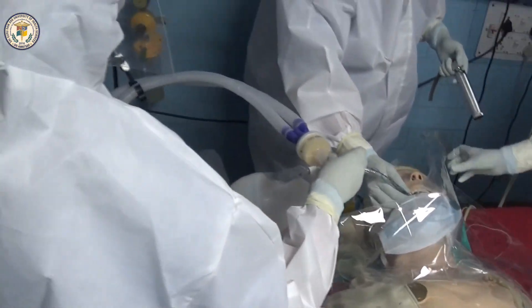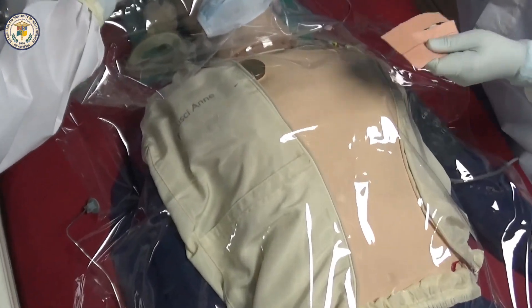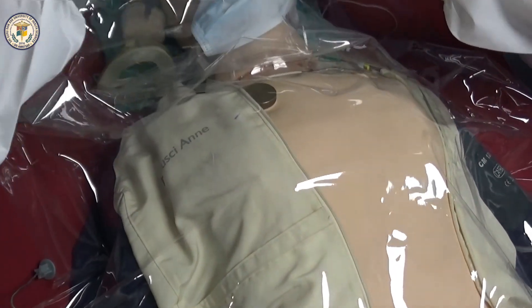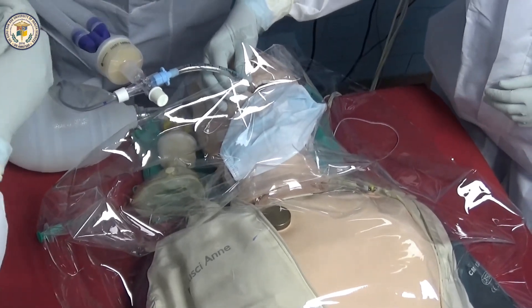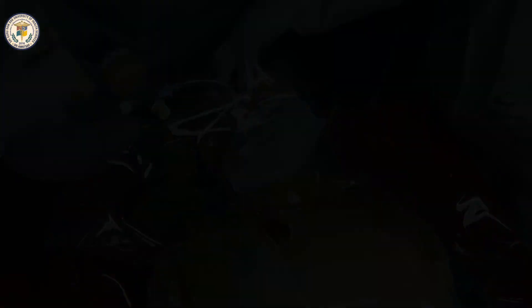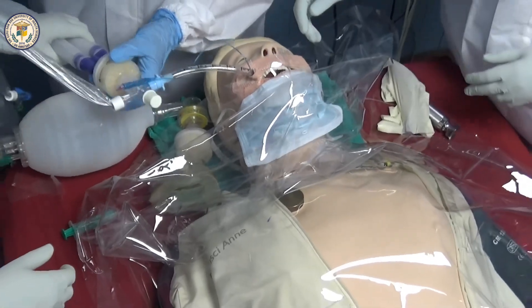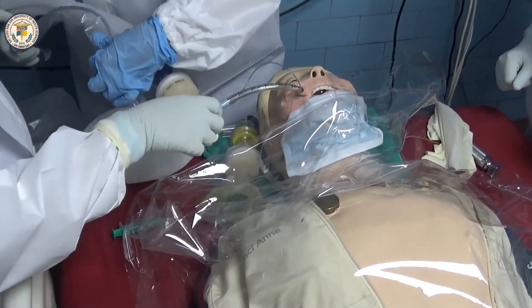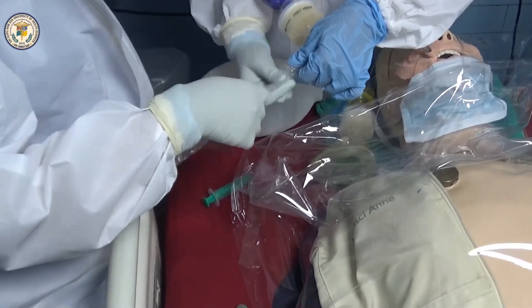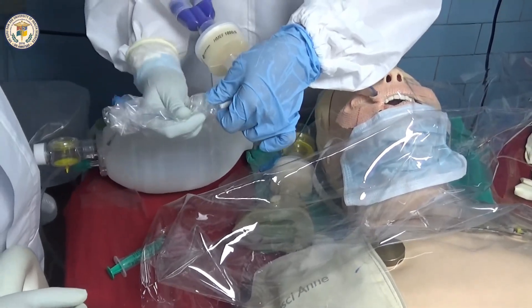Re-sheath the used laryngoscope blade with the outer glove worn by the operator. After confirming tube placement by visible chest rise, ventilator waveform, or capnography if available, secure the tube properly to avoid dislodgement. Use a closed airway suction system and avoid unnecessary ventilator disconnections. Discard all unused items on the drug tray and decontaminate all equipment before reuse or disposal.